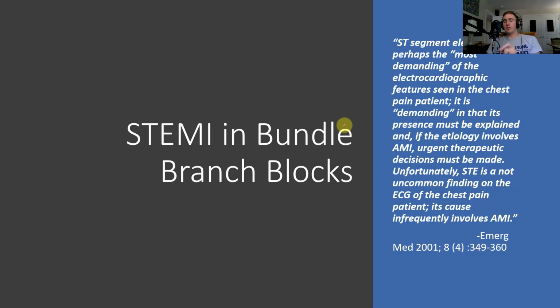So I want to read this quote from Emergency Medicine Journal in 2001. It says, "ST segment elevation is perhaps the most demanding of the electrocardiographic features seen in the chest pain patient. It is demanding in that its presence must be explained, and if the etiology involves MI, urgent therapeutic decisions must be made. Unfortunately, ST elevation is not an uncommon finding on the ECG of the chest pain patient. Its cause infrequently involves MI."